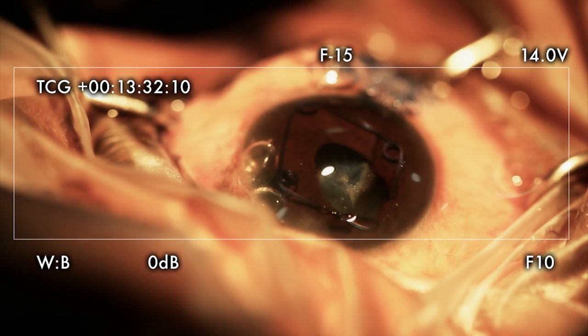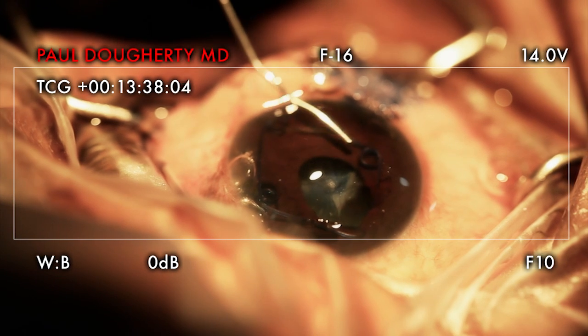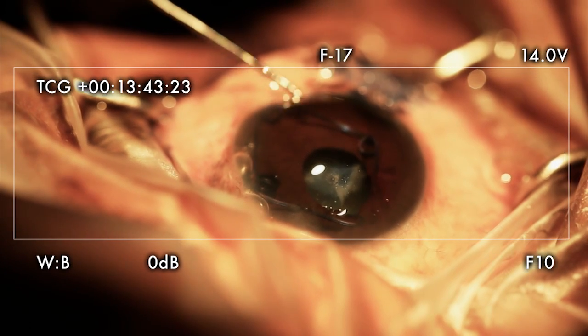It's viscoelastic. Turn the lights off, please. Is she okay? She seems to be a little discomfort. Maybe a little bit more. That viscoelastic's just like that.